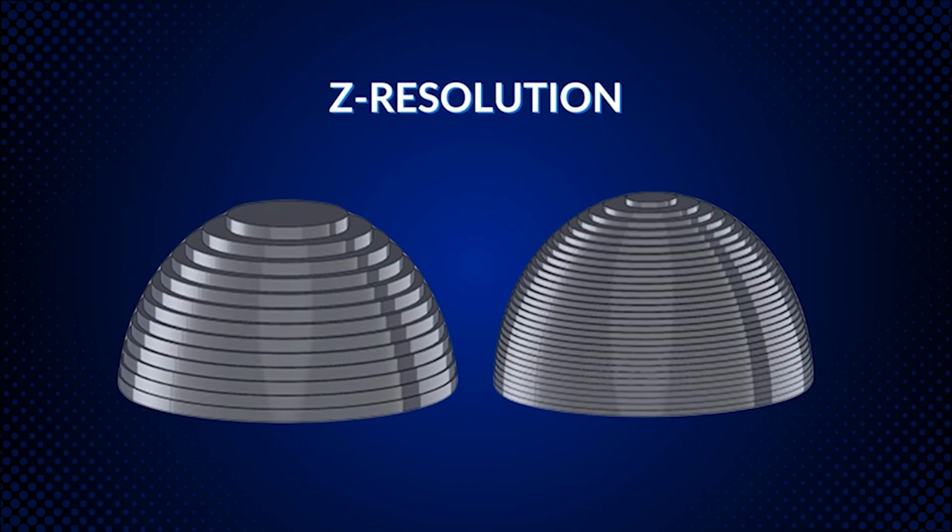So first, I'm going to start off with Z resolution. I know you guys have all heard the terms, how do I print this? 50, 100, 75? Your micron slices, as I've shown on the slide here. Accuracy isn't really a term that I like to use when it comes to that, because really overall, the object is still the same size. It is very accurate. But the size of the slice that you have will in turn give you a surface finish or a topography.